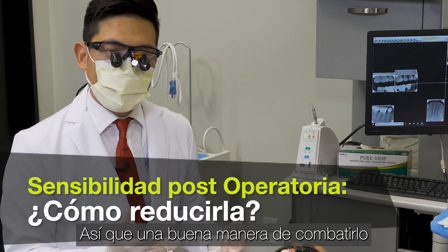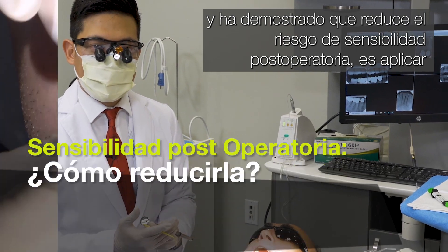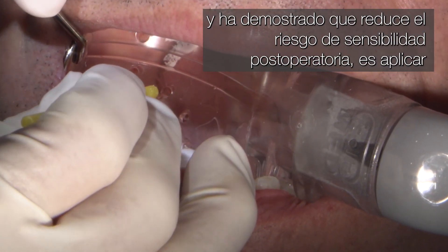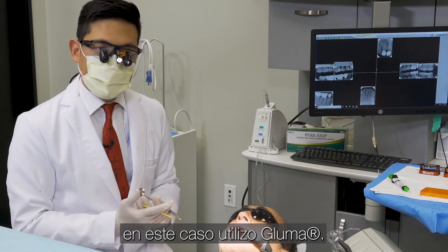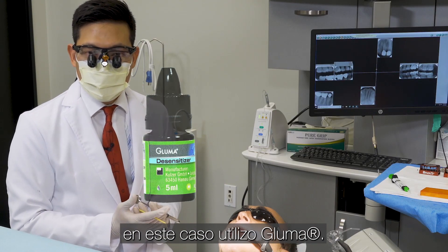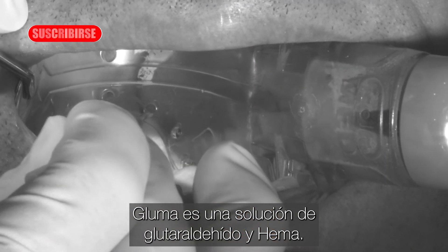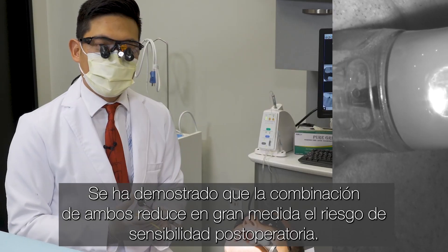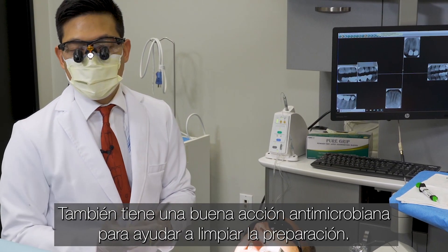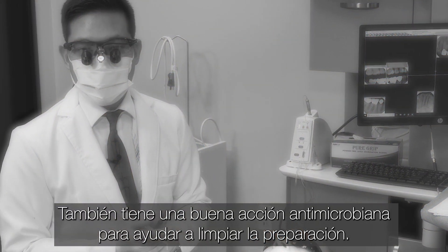A nice way to combat that, which has been proven to reduce the risk of post-operative sensitivity, is to apply a desensitizing agent on the preparation. In this case, I use gluma. Gluma is a glutaraldehyde and HEMA solution. That combination has been shown to greatly reduce the risk of post-op sensitivity, and it also has a nice antimicrobial action to help clean the preparation.